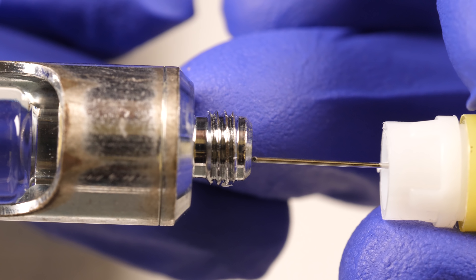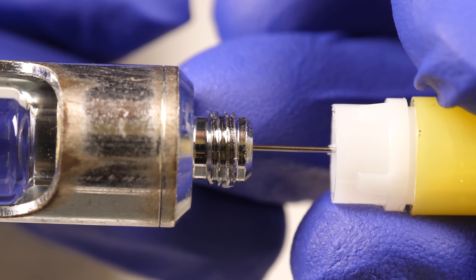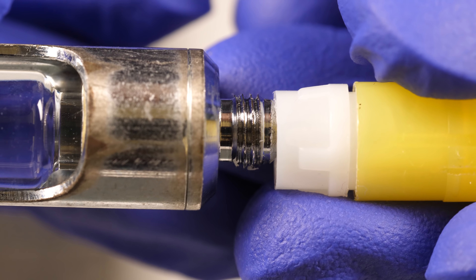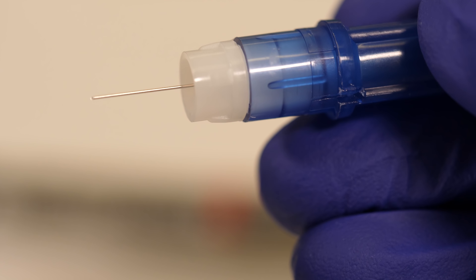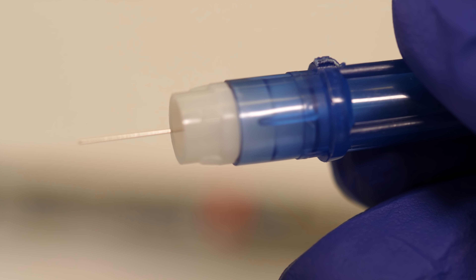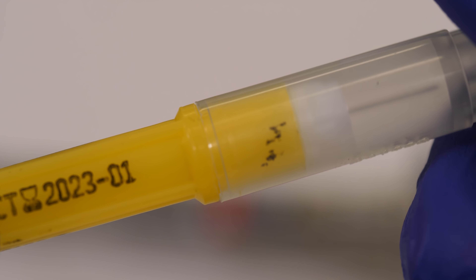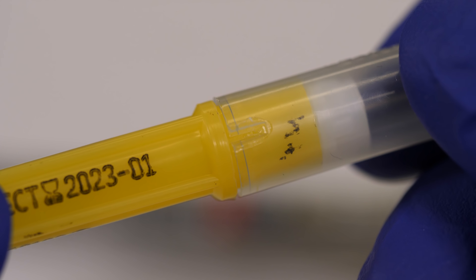At the end of the syringe, there is an adapter that allows for needle attachment. We typically use a short blue 30-gauge needle or a long yellow 27-gauge needle in the dental school clinic.